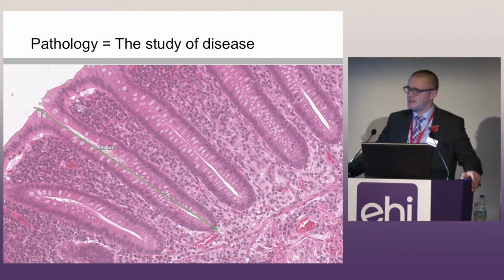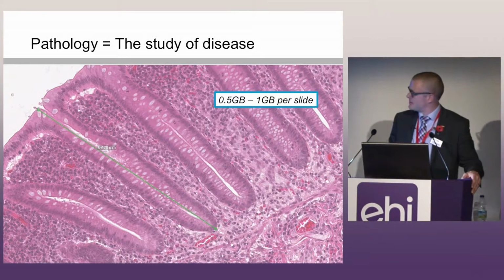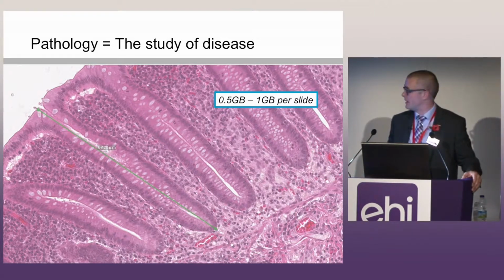Now, a particular study may take in up to 50 slides. So it'll come as no surprise to the IT guys in the room that each and every slide could weigh as heavy as half a gig or a gig per slide. So this is a significant change to the way that you guys do things.